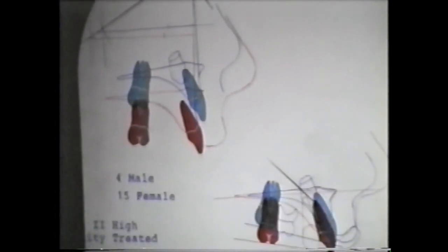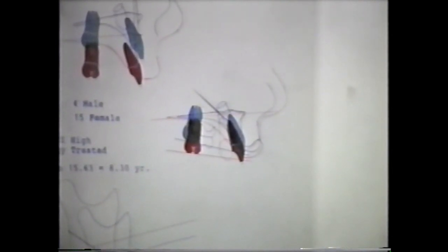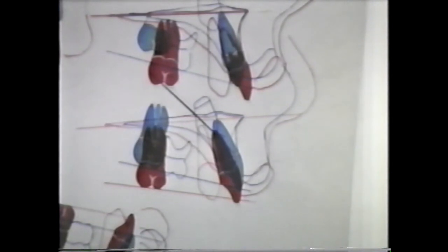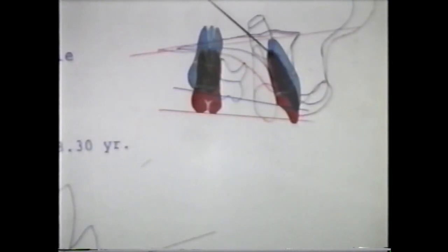Now here is position 3, and even after 10 years you will see that the upper incisor has moved backward. Just for comparison, we'll show you here again what it did without treatment in normal growth. And these are class 2 cases that would probably have the upper arch going forward even more. So here is the behavior without treatment. And here is the behavior with treatment, both in the upper molar. Alright, now we will look in the lower arch.